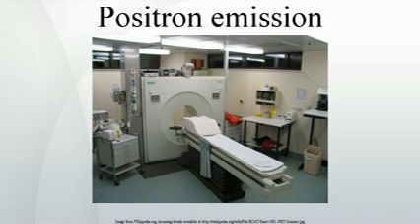Use of this tracer to explore the possibility of cancer metastasis, that is, spreading to other sites, is the most common type of PET scan in standard medical care, 90% of current scans. However, on a minority basis, many other radioactive tracers are used in PET to image the tissue concentration of many other types of molecules of interest.